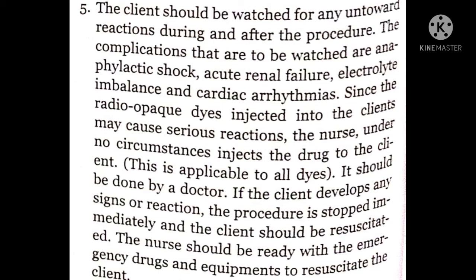Since the radio-opaque dyes injected into the clients may cause serious reactions, the nurse, under no circumstances, injects the drug to the client. This is applicable to all dyes. It should be done by a doctor. If the client develops any signs of reaction, the procedure is stopped immediately and the client should be resuscitated. The nurse should be ready with the emergency drugs and equipment to resuscitate the client.